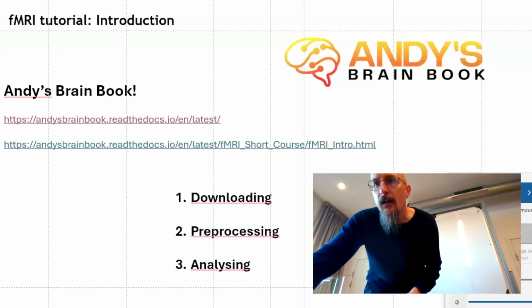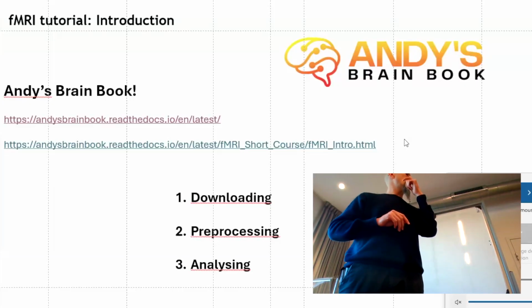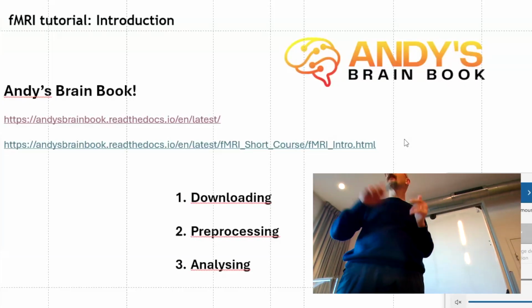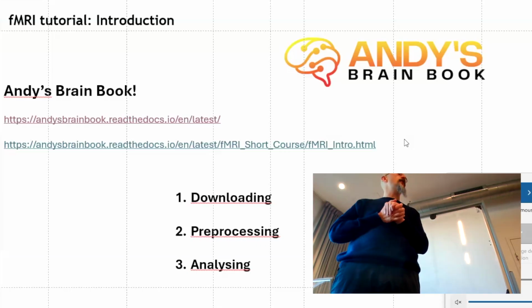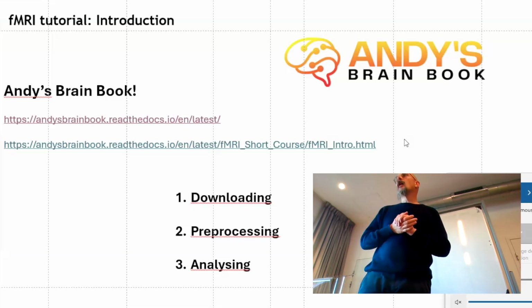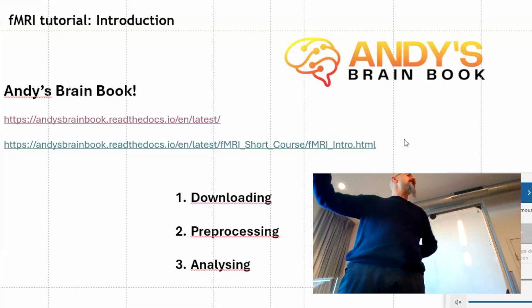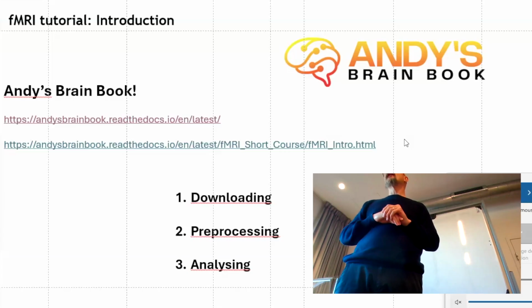Michel has sent you an email with a GitHub link, and I think all the instructions are there, and the website is indicated on this fMRI tutorial GitHub page. The reason is that it's really good, so you can follow along, and go back to all the instructions.